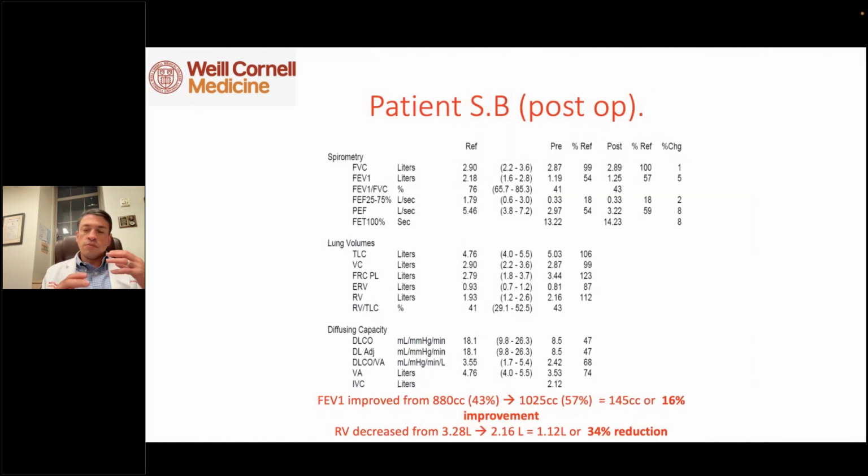So when I'm seeing a patient in consultation, the patient will always ask, what is this going to do for me? What type of improvement should I expect? And I think it's a very complicated question to answer, but I think that if we have a phenotype like this patient with a healthy lobe and a lobe that can be closed, we could really expect the patient to do well and come off of oxygen. When we have homogeneous emphysema, or when we have more diffuse degree of emphysema, even if it's heterogeneous, I think the benefits are still there, but they may be less robust.